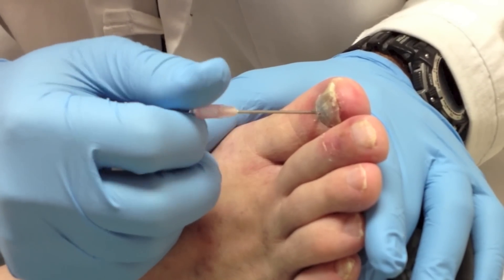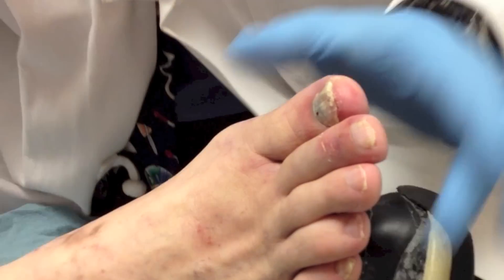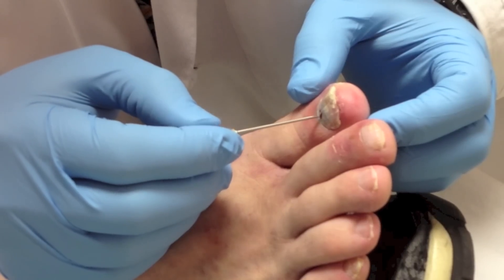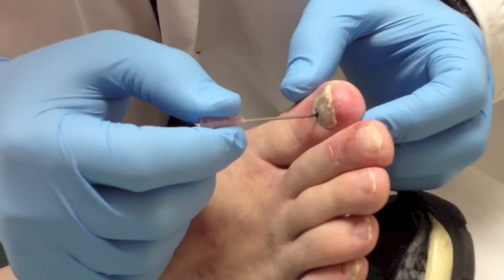If I was at home and didn't have a needle or anything sharp, I would use a paper clip — I would heat it up. The heat itself will break through slowly, but you have to be careful because you could burn yourself doing that.